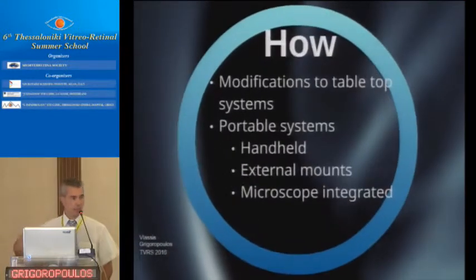But slowly, some people started thinking that it might be useful to have it done during surgery. So they thought about how they could do it. You could do a modification of the tabletop system that you had already. Or you could create new portable systems, like the handheld OCT, externally mount the OCT to the microscope, or have solutions integrated into the microscope.